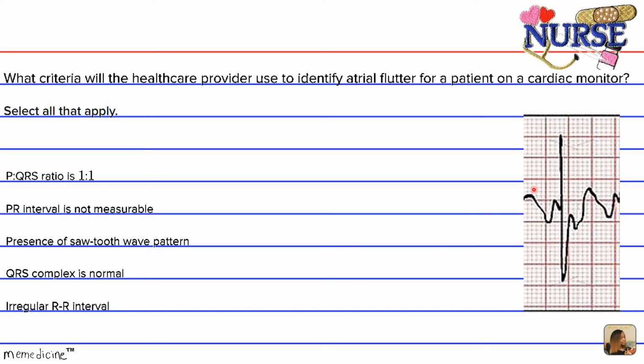Just for more guidance, this is what the EKG of an individual with atrial flutter would look like. All right, so I'll give you a moment to select the correct waveform patterns.